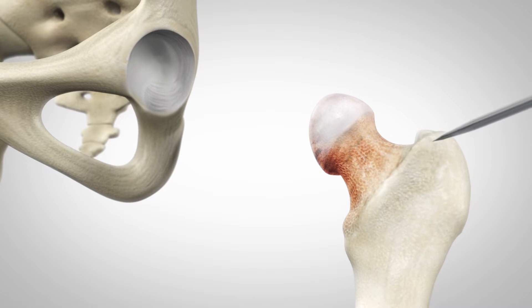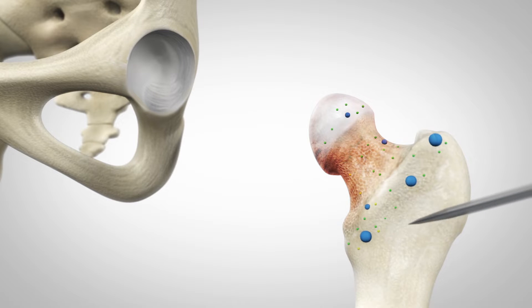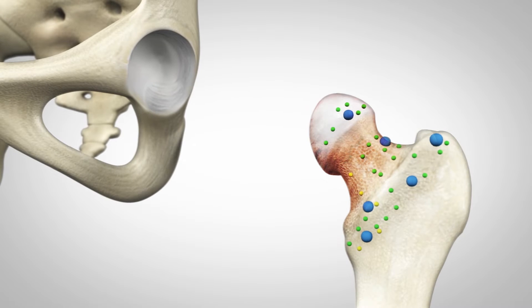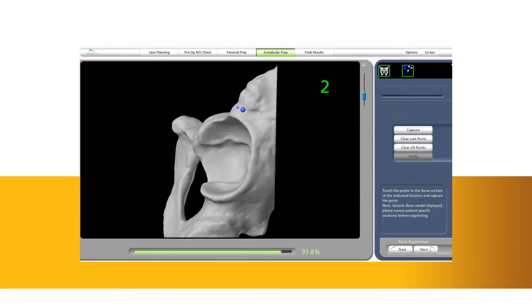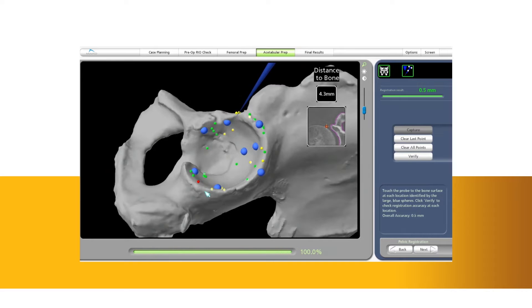During surgery, the surgeon locates points on the hip in order to register the anatomy in the Mako system. This process establishes the relationship between the patient's actual anatomy in the operating room and the 3D model that was used during the planning process. This step helps ensure the procedure is executed to plan.